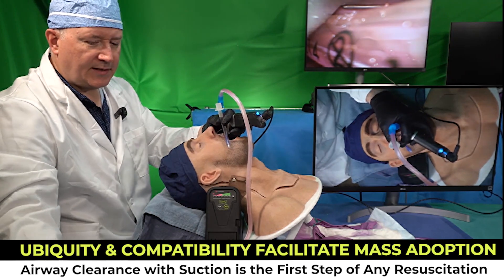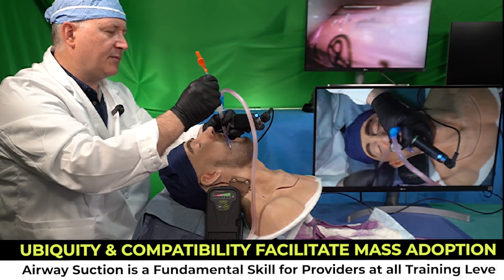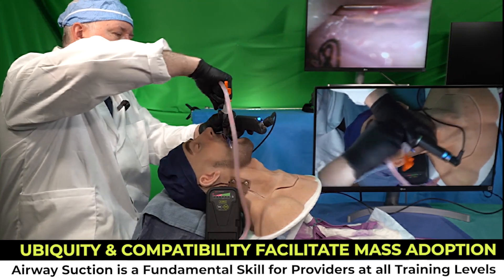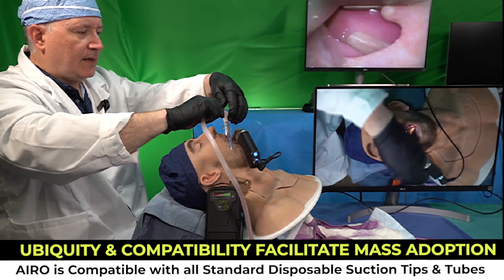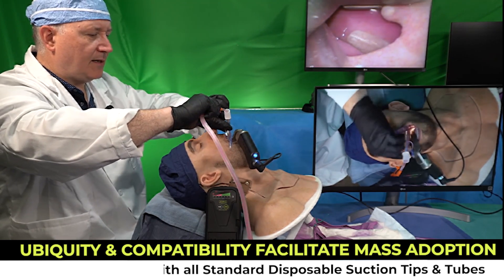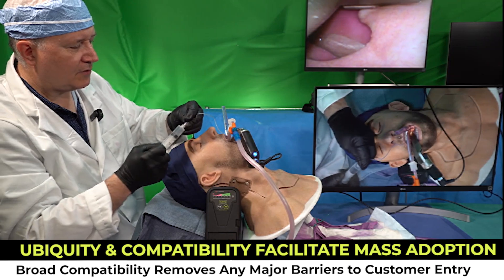What I'll do now is decontaminate the tracheal tube prior to ventilation by passing a flexible suction catheter down the airway, moving my suction from the rigid catheter to the flexible catheter, and decontaminating the airway distally. And of course, in the midst of this, I'm going to inflate my tracheal tube cuff.